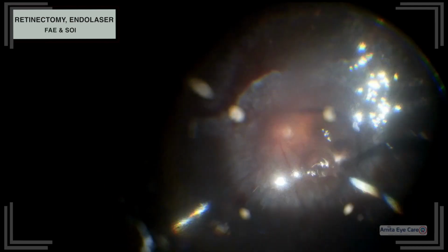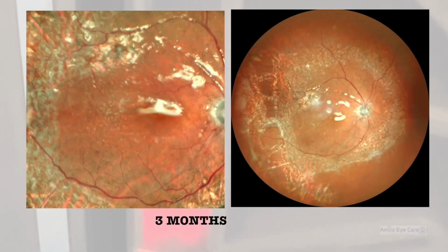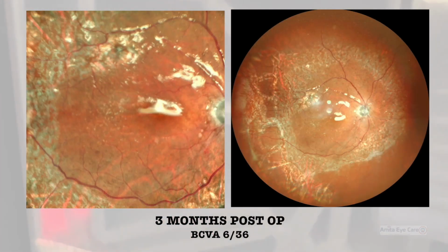The rest of the surgical steps were similar to the first case. 3 months post-operatively the retina was attached under silicone oil.